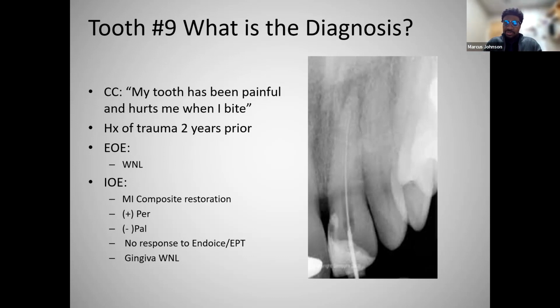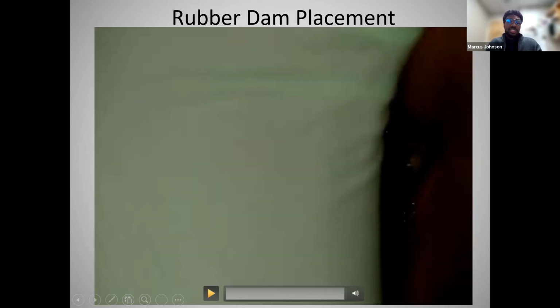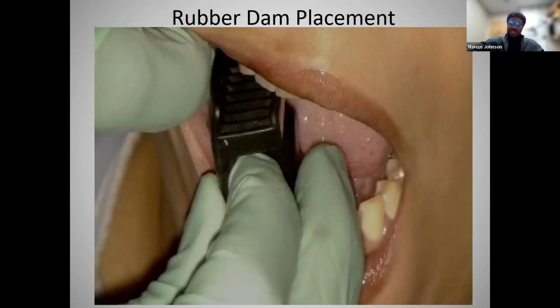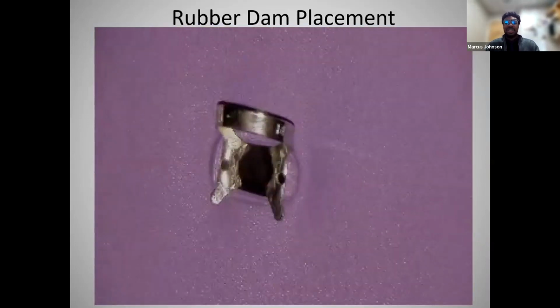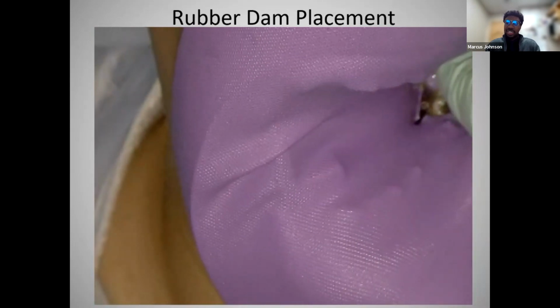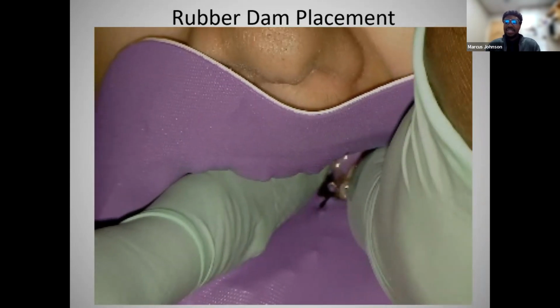But we like to make a change for the sake of the patient. So I always love to just show how I practice. This is just very basic. You may take a different approach in how you manage your cases and place the rubber dam. This is just a patient. I always place a cotton roll because I have big hands when I'm working. I can often push on the bottom lip and it can go into the incisors and be painful to the patient. I love this rubber dam because it's all one unit, and it's very flexible if I need to stop and take intraoral radiographs, without having to make too much adjustment to how I practice.